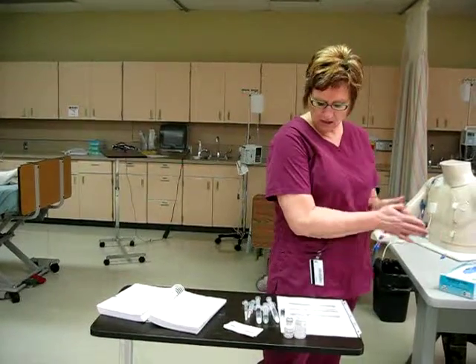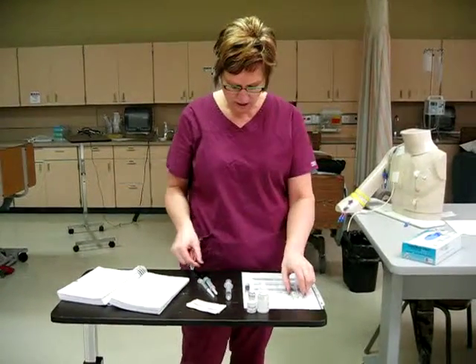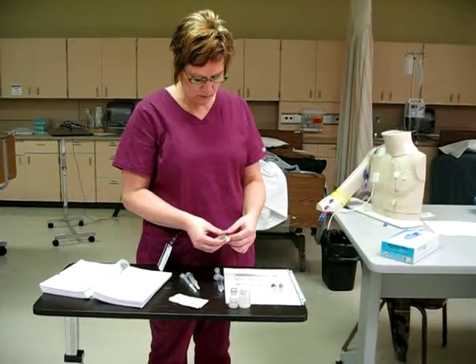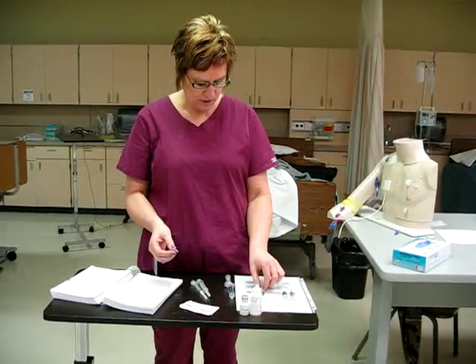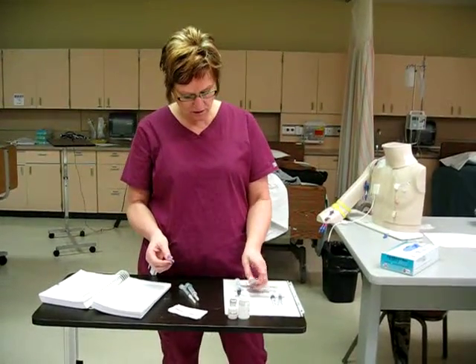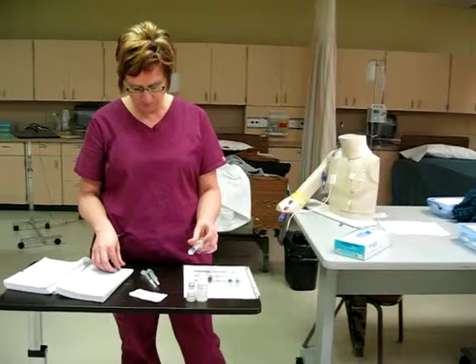I'm going to put on my gloves. I have my 2 normal saline for flush. I'm going to have my heparin, because he's heparinized. So I'm going to have my heparin ready to infuse after I'm done with my normal saline flush. And then I'm going to give the Dilantin with 5 milliliters normal saline.